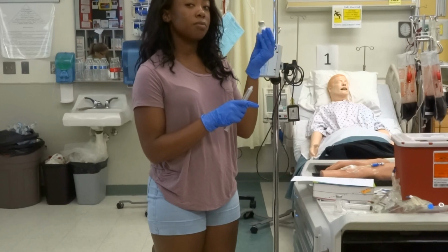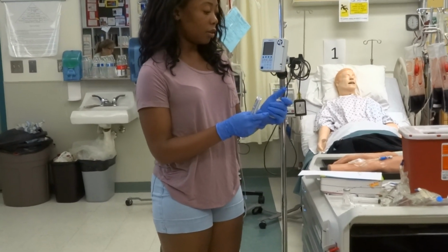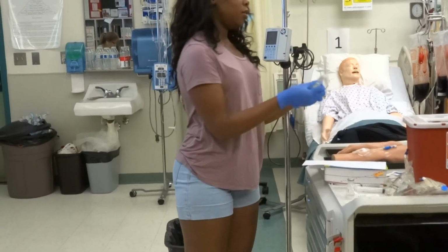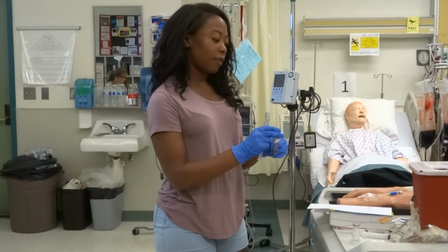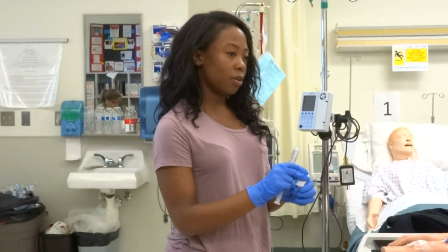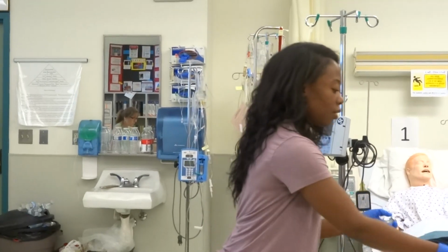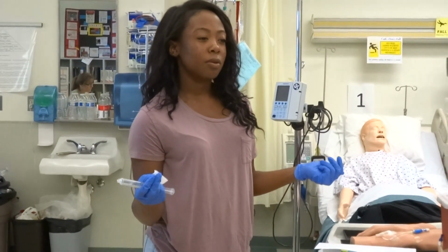This is Protonix. It comes as a white powder, okay? Pop off the lid. It's gonna be a new one. And since it's new, you don't have to, but I don't know if you guys have actually seen your nurses do something like this, cleaning that off for insulin and stuff. Whatever. Well, everyone's been using the insulin, so it only makes sense.